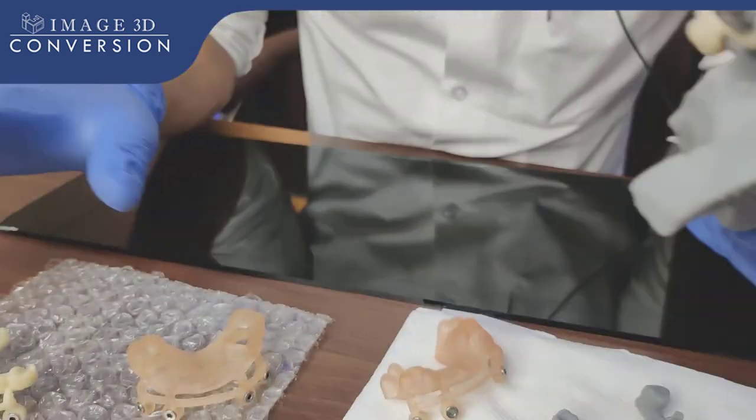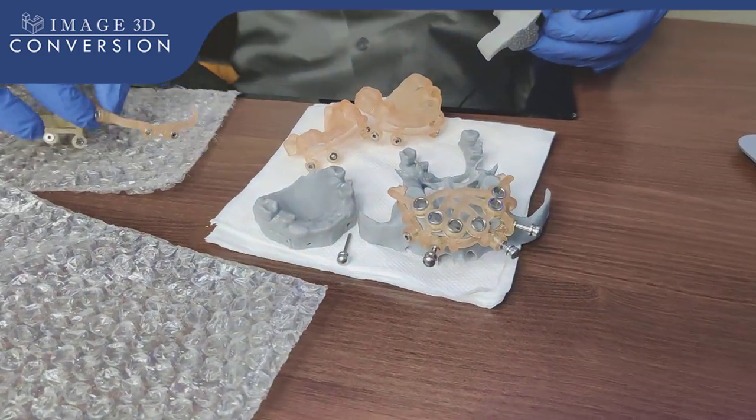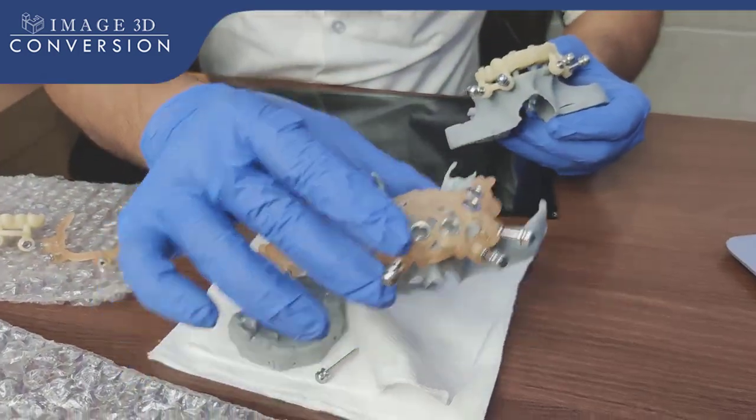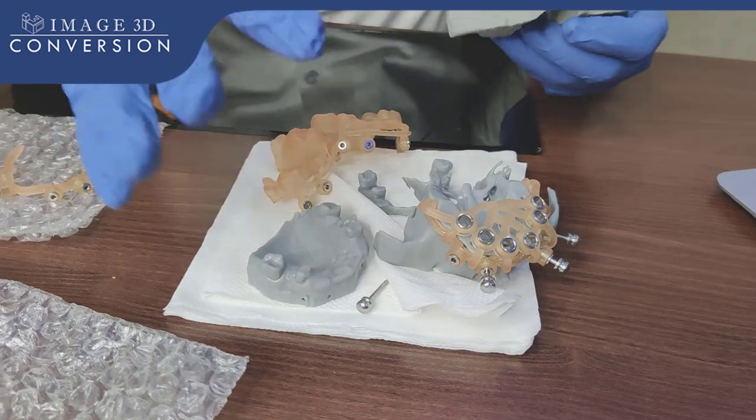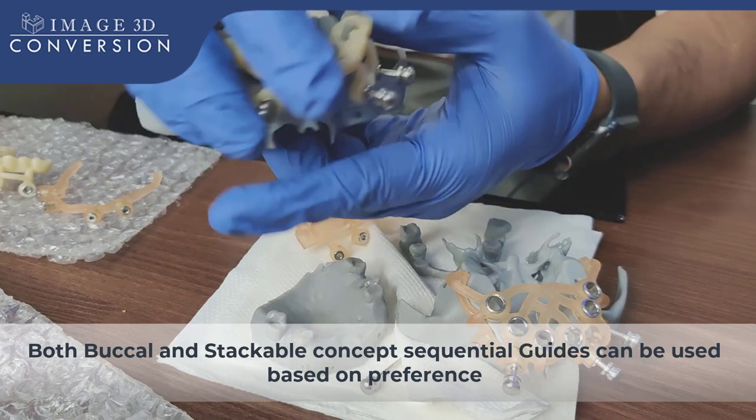You can see all the guides: the tooth-supported surgical guide, one is bone reduction guide, then one is osteotomy guide. Once you are done with implant placement, take the pickup with the temporary pickup holes with the same indexing positions.